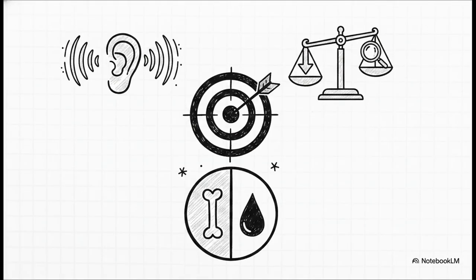Here is your rapid-fire summary to cap things off. Number 1. Understanding physics is absolutely not optional. It is the bedrock of diagnostic accuracy. Number 2. Our echo tools operate far above human hearing, typically at 2 to 10 megahertz. Number 3. Always remember the trade-off. Frequency is inversely related to penetration, but directly related to resolution. And number 4. The image you see is just a map of tissue reflections. Strong reflectors like calcification appear white, and non-reflecting fluids like blood appear black.